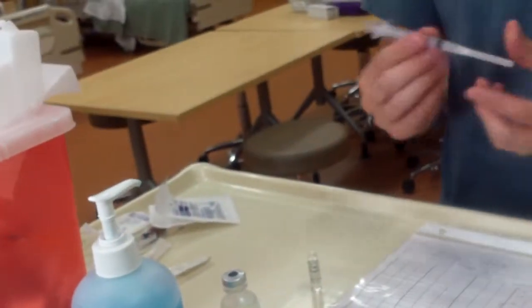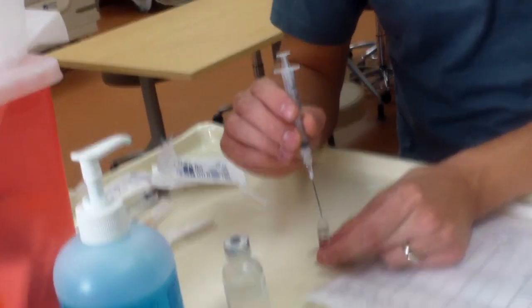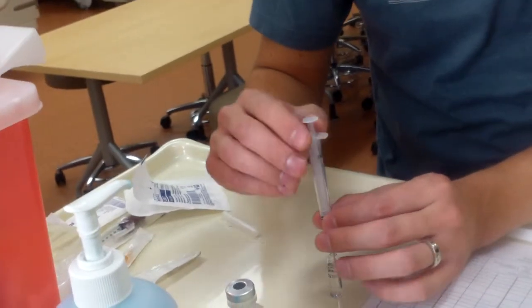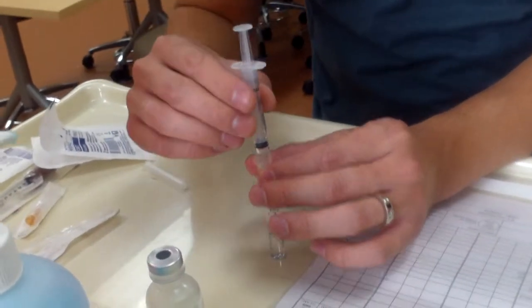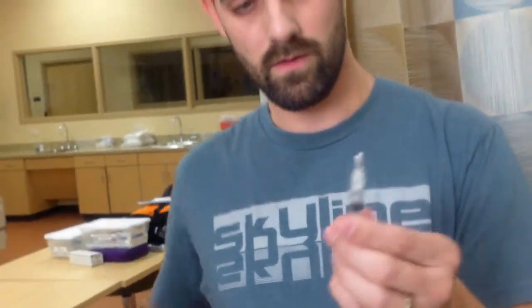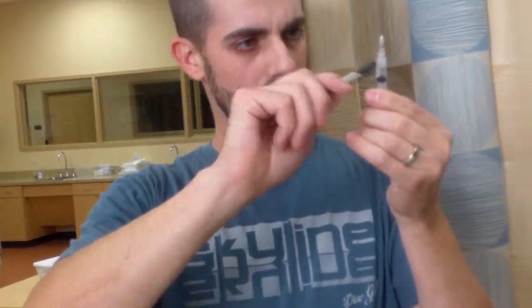Okay. And then I need to withdraw my medication. So I use a filter needle going right inside, not touching the base. I'm going to withdraw my medication without aspiration, with a little bit extra for any air bubbles. Draw that. Okay, get all my air bubbles out of this. And then I'm going to move the bubbles out. Let's just put one more on the side there. Alright, and then move the plunger up to the right dosage. There we go. Got it.